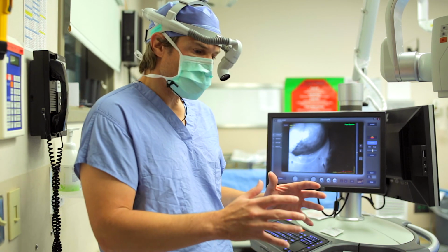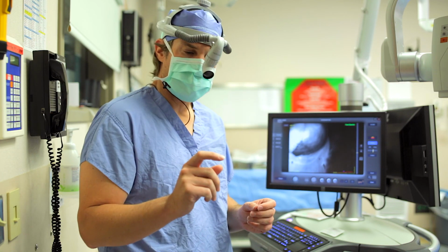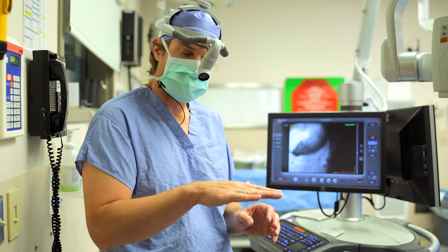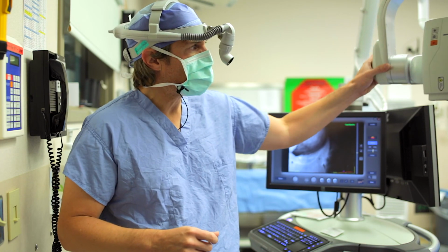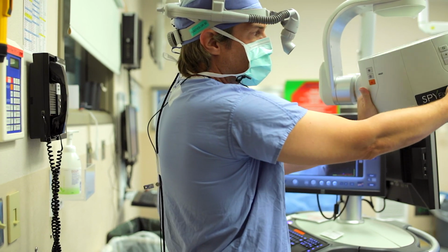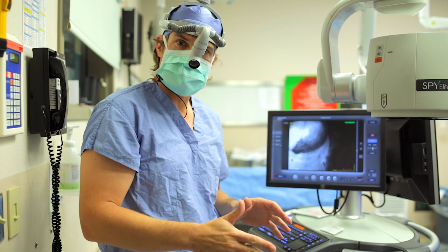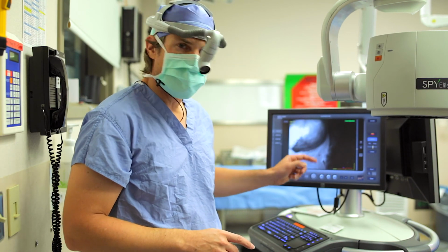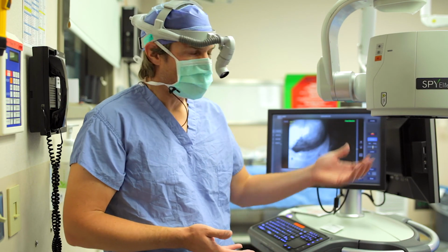On curved images, as we talked about before, this dye is shooting a light up towards the camera. So on a curved image, what you will see the best is the very top of a curved image. Around the corner, it's shooting the light out that way. So that's why this handle articulates, right? So this is why you can move the handle this way and that way to make sure that you're seeing the absolute perpendicular surface so that you can measure what you're looking at. So I would say that this area around the corner, it's giving me a falsely dark result because that light's being shot off to the side, not up towards the camera that's being received there.